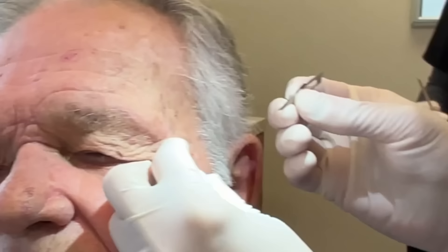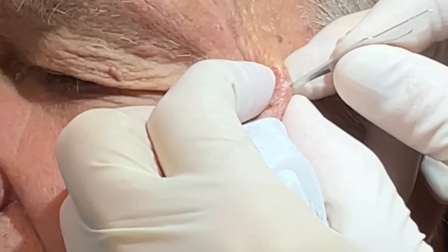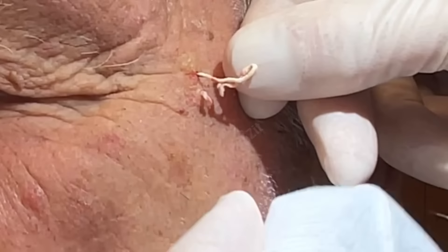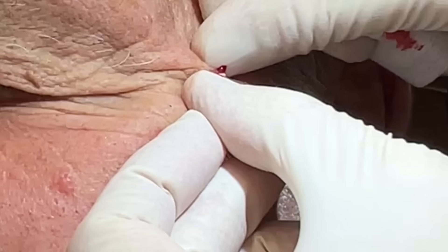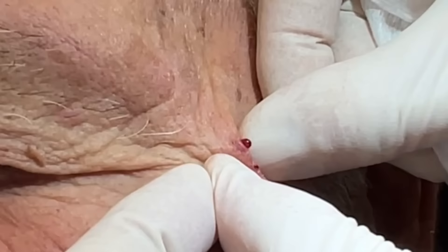Now with these whiteheads here we'll do just a little poke with the 11 blade, just right at the surface. He's got one right beside it — a little vessel right there too. And I can squeeze these out with a finger squeeze. Usually some pretty good stringers come out of those. They're basically just a small follicular cyst. We'll get a band-aid for that one because we hit that one tiny small vessel — you can see it was right over that one.